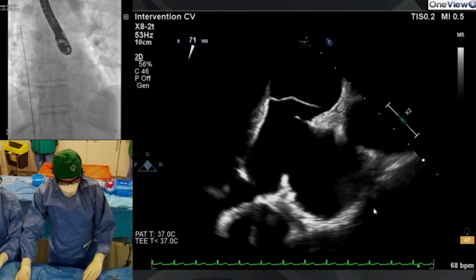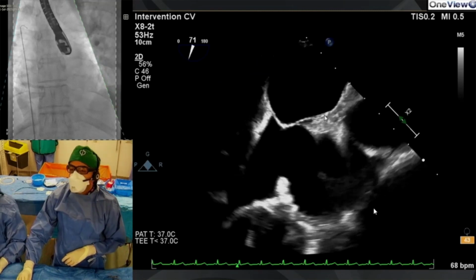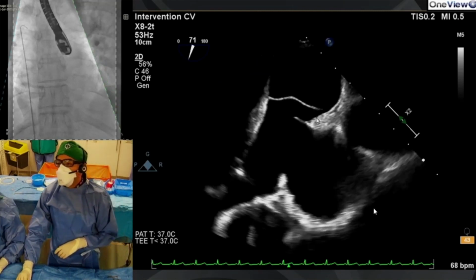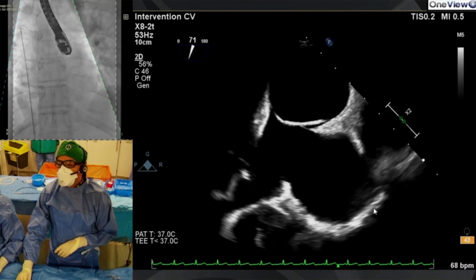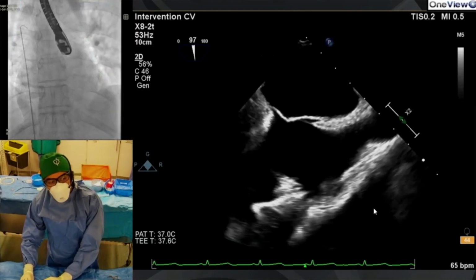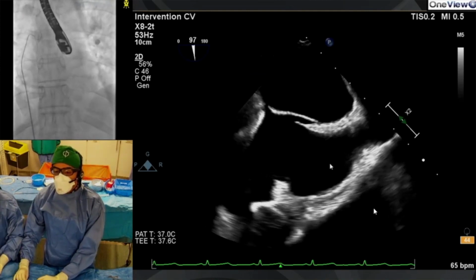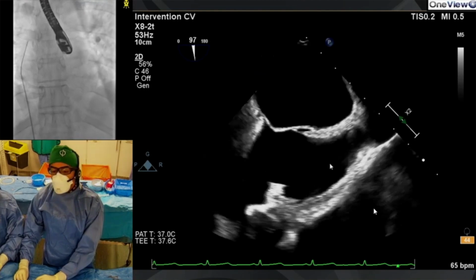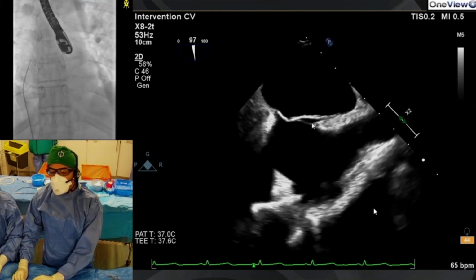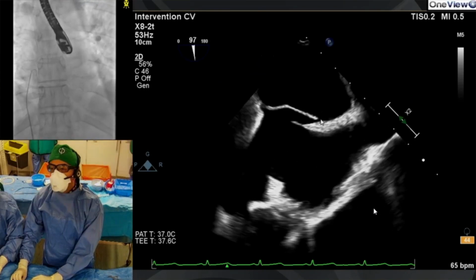But what's also interesting is there's a slight lip of tissue here, yet the opening seems relatively tethered. So moving along to your 90-degree view. So again, we can see a bit of the opening of the PFO, but you can see there's quite a lot of breathing movement here, which is actually causing the image to move quite a bit. But you can see the opening beautifully here towards the SVC now, clearly.